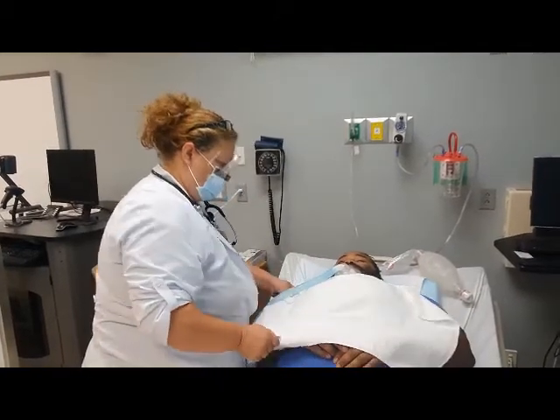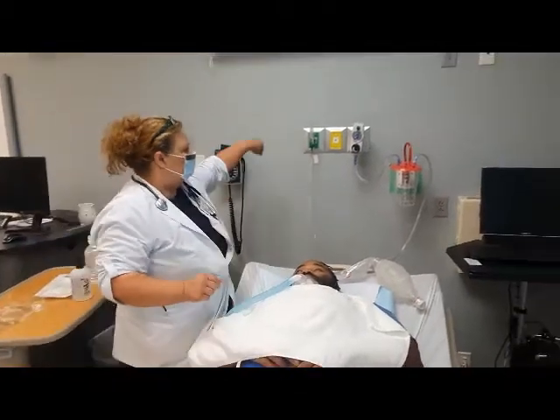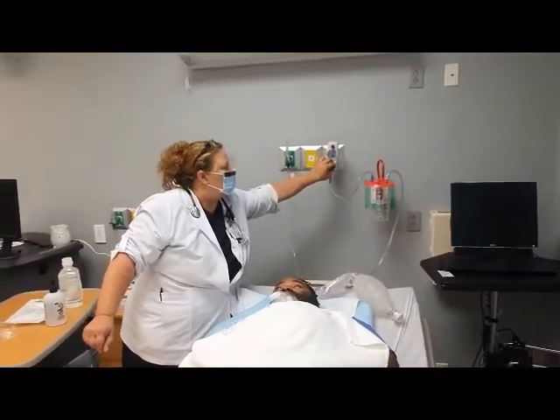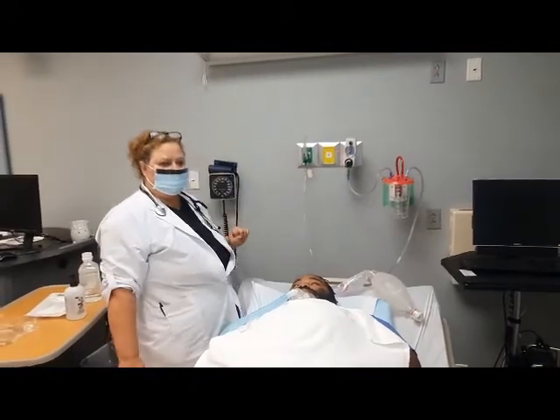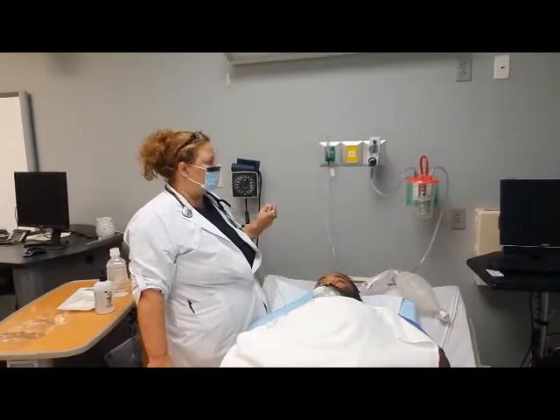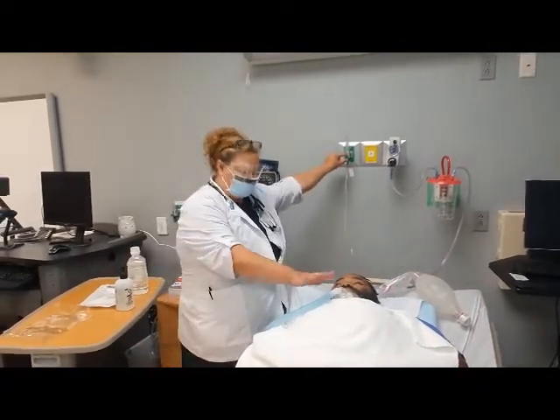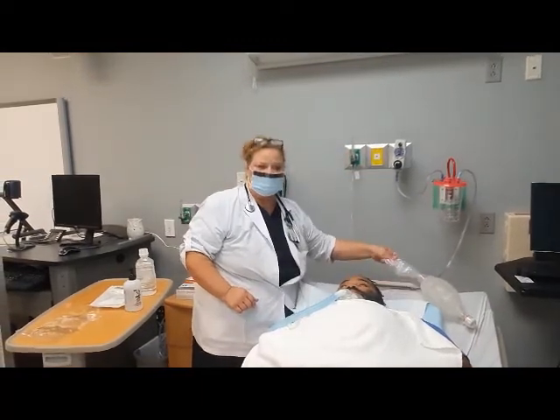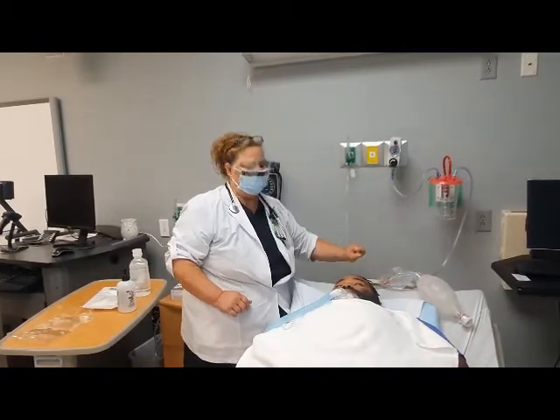Turn your suction source on to continuous suction at 100 to 120 millimeters. Do not exceed the 120. Get the dial to about 100. Set the O2 flow meter that's connected to the bag mask to the highest flow rate. Then this right here will inflate normally, so you would know that you are where you're supposed to be.